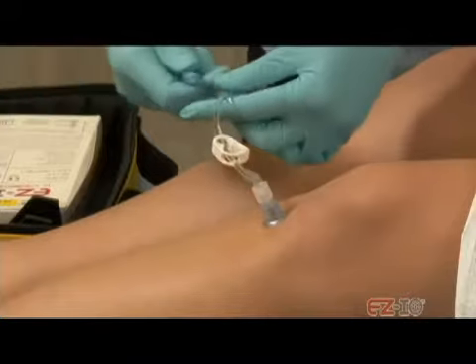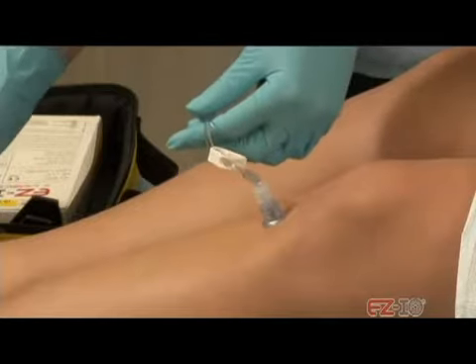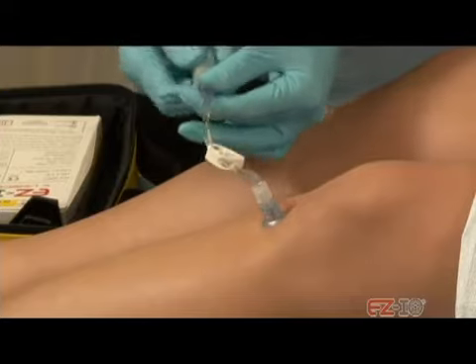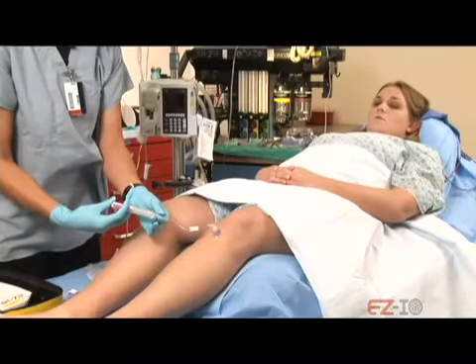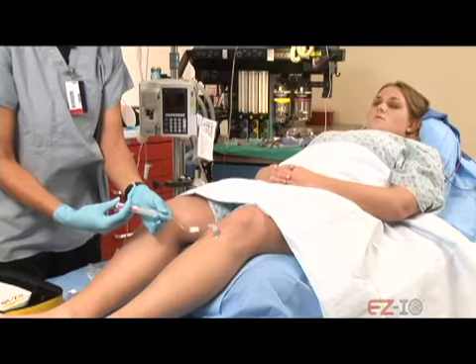So I'm still going to give you a little more lidocaine to manage that pain. Doing okay still? What's your pain level? Like a 3.